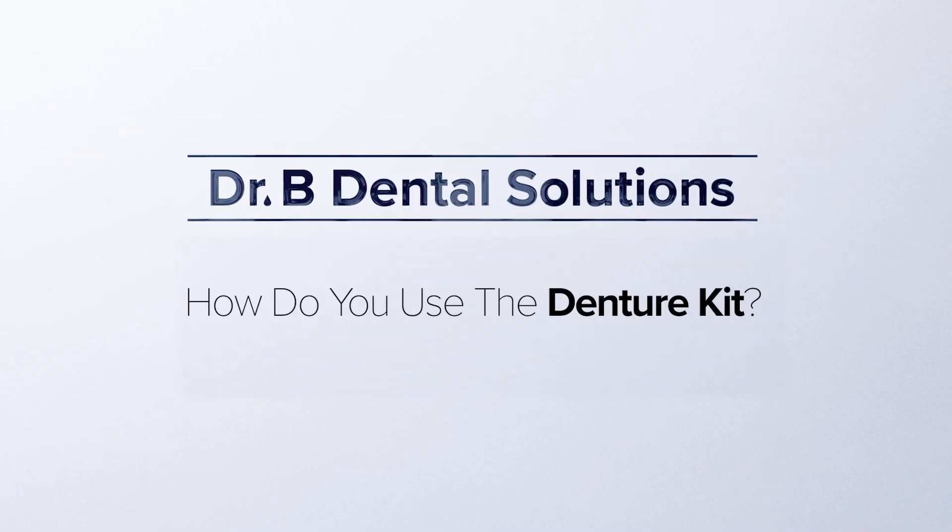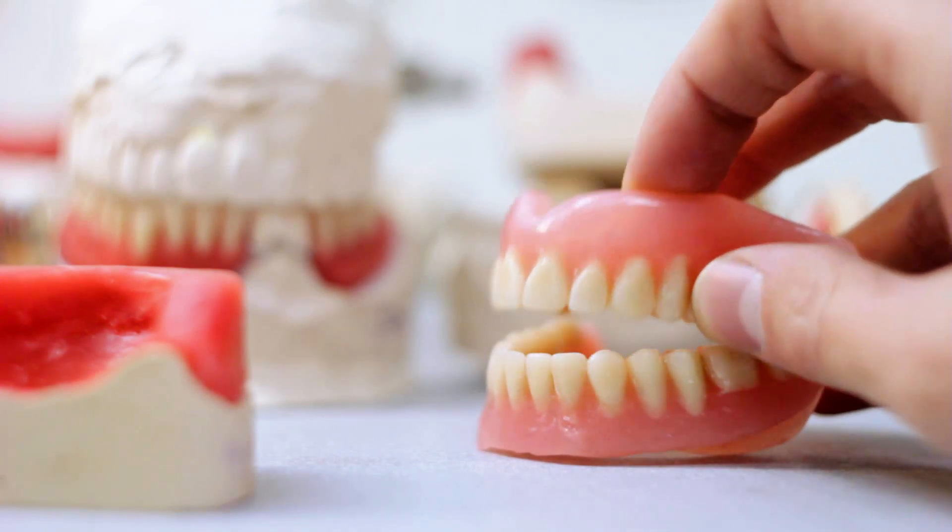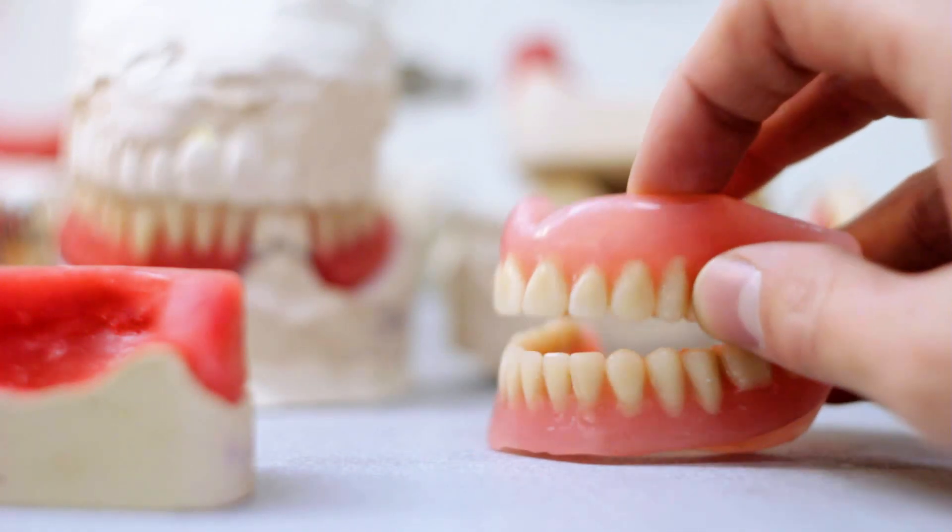How do you use the denture kit? The denture kit is very simple — it has everything you need. Whether you have a partial denture, a full denture, an immediate denture, or a snapping over denture, we've got you covered.